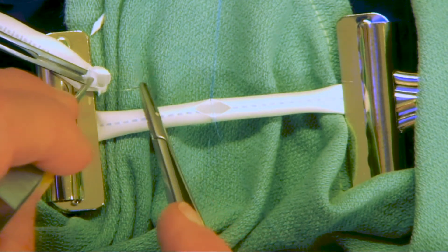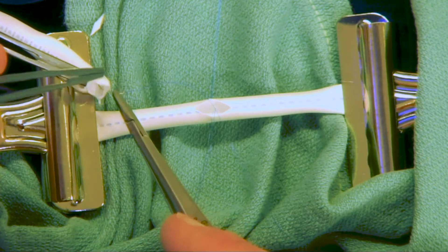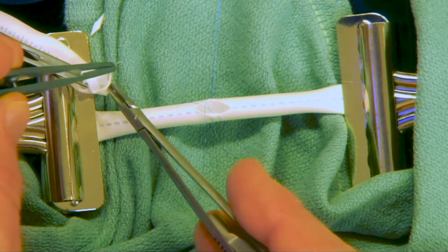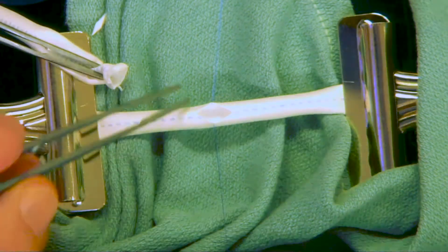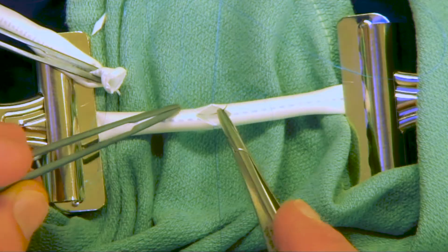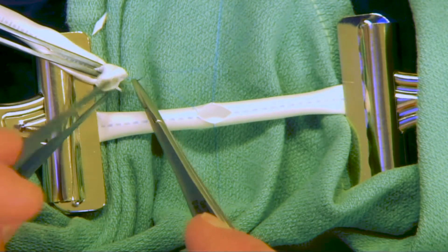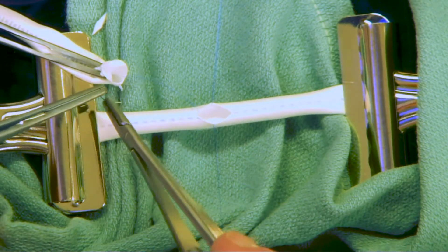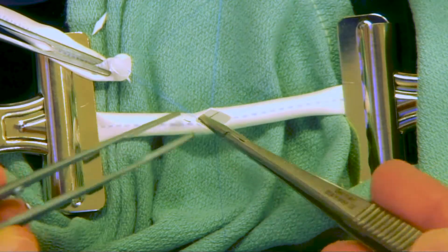We'll start at the heel of the donor vessel and go one suture off of the heel, trying to keep the needle tip outside of the blood vessel so it's easier to grasp. We're careful to avoid locking our suture, reaching around the suture line so that we don't get ourselves tangled, and again trying to keep our needle tip outside of the blood vessel so it's easier to grasp.